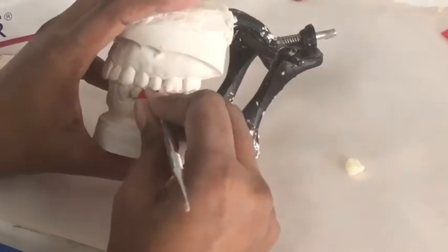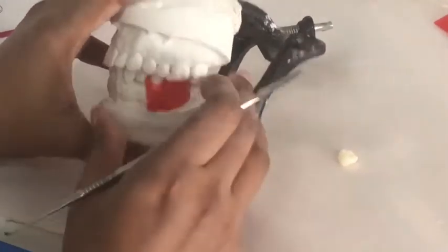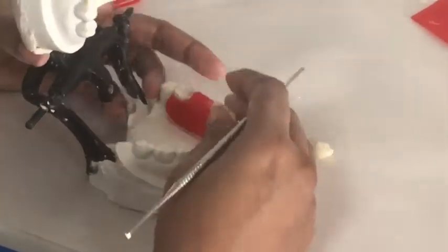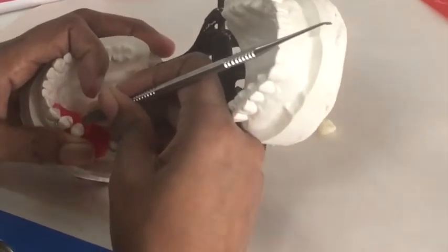The cusp tips of the mandibular premolars will engage the embrasures of the opposing teeth. The buccal cusp of the mandibular second premolar will engage the embrasure between the maxillary premolars and first molar.